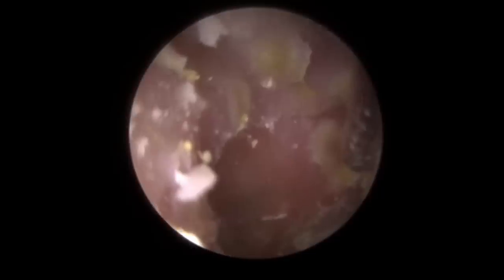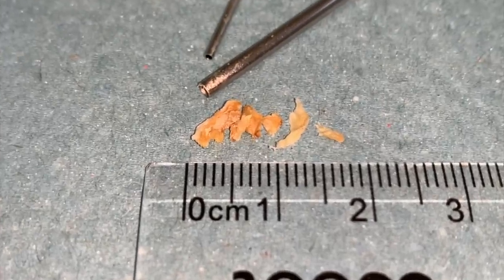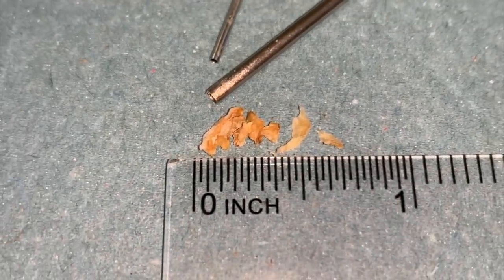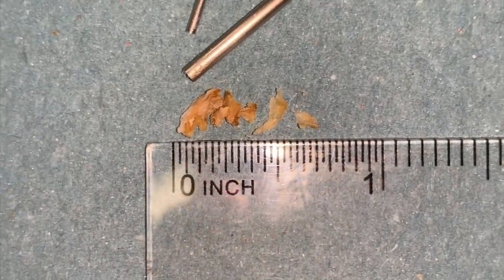There's a little patch to the right-hand side, but I think this patient has done really well today — to sit through all of this, they did really well. So we're going to take that away and call it a day there. What we've said to this patient is to carry on with the drops. You can see there are a couple of little bits remaining, but we can actually see part of the eardrum there — looking very red and aggravated. The patient is going to go away, carry on with the drops, and come back in a couple of weeks. This is what we removed — looks really unimpressive, but it was just such a difficult one to do. A really interesting case to share.